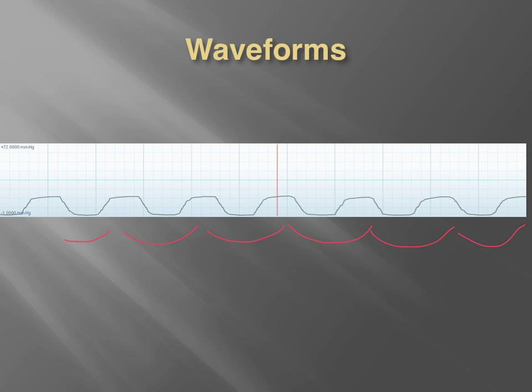If we're counting our 10 boxes again, we have 1, 2, 3, 4, 5, 6, roughly 7. All right, 7 times 6. Not much of a math whiz, but I'd say that's about 42. At the best, we're talking a respiratory rate of 36, 6 times 6, if we don't count this last waveform here, since we're between 10 and 11 blocks.